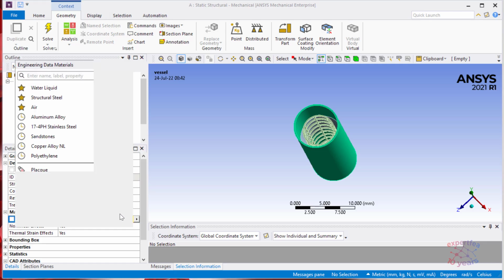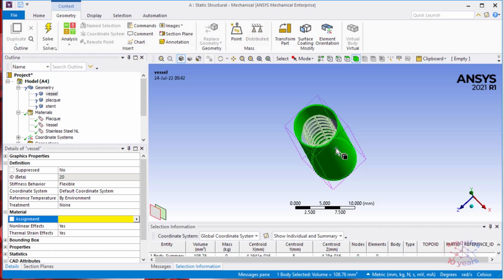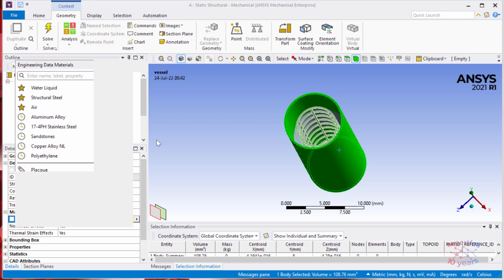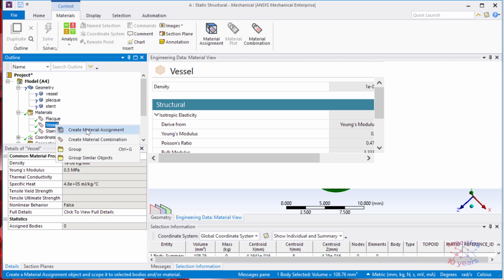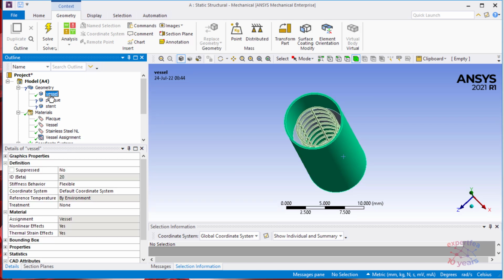So we assign the vessel material. This is a well-known bug here, so we need to go to materials. Let's select the vessel. Just make sure that this very intense green is shown for assignment. So select the vessel, then go to vessel here, right click, create material assignment. Now when it became red, we know that the proper material is here.